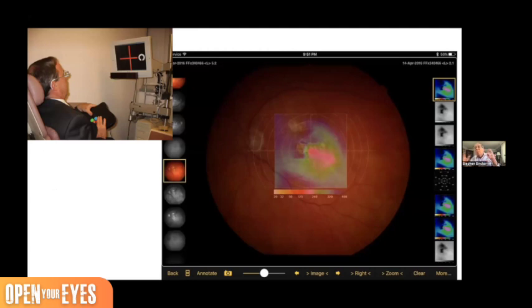So very quickly, because I'm limited in terms of the amount of time left, we're doing now microperimetry with retinal cameras that will be able to stabilize so we can look at the defects over the lesions that we're imaging. That's good, partially, but still, with most of the microperimetry and the parametric Humphrey visual fields that are done, most often they're done with photopic visual field analysis. And that's utterly wrong because those cones are the last that are involved. The rods, we're now realizing, are much more involved earlier.